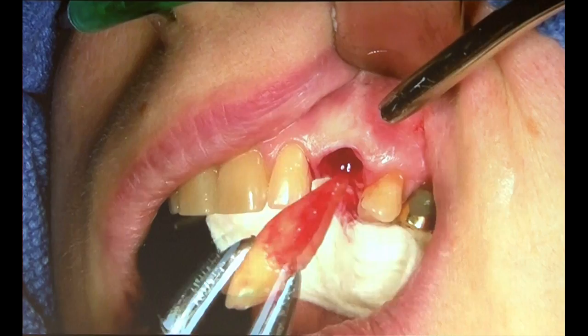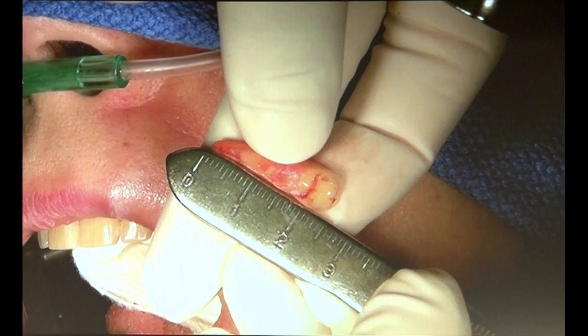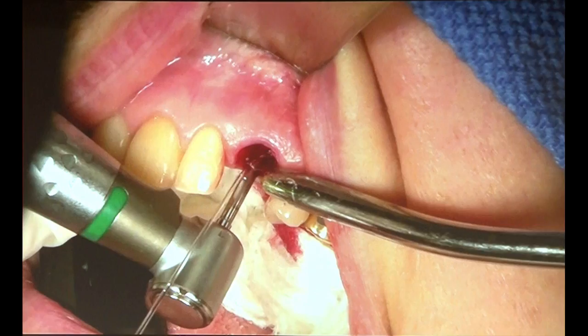And here you can see no internal resorption, but on the other side, as you'll see here, right at the cervical margin of the root, the internal resorption that was occurring. So we want to make sure that any of that granulation tissue that is responding to the internal resorption is removed, and then the preparation of the implant site.